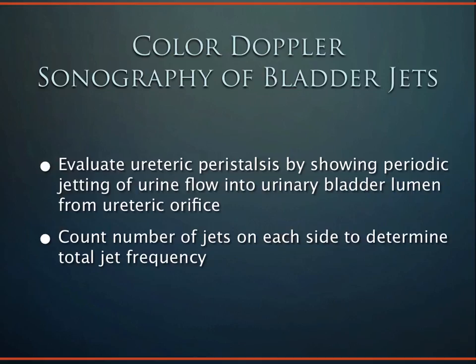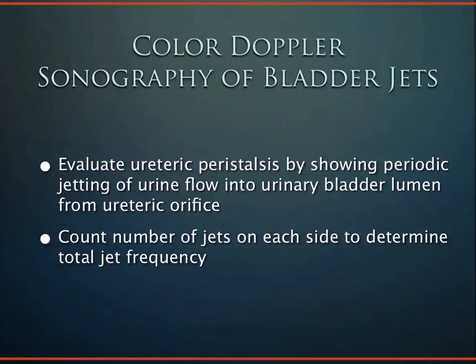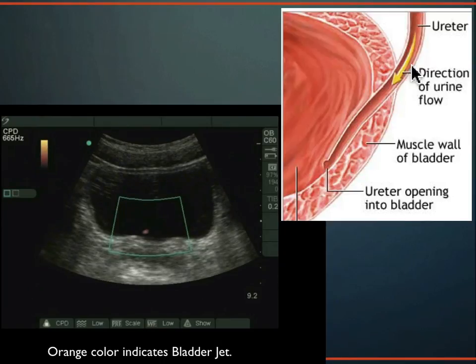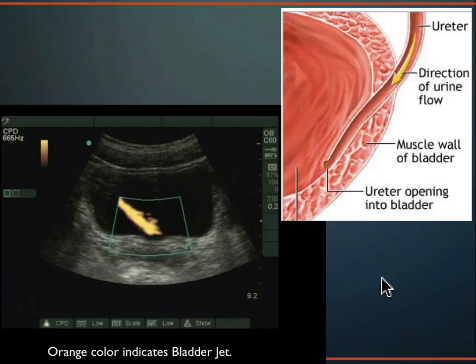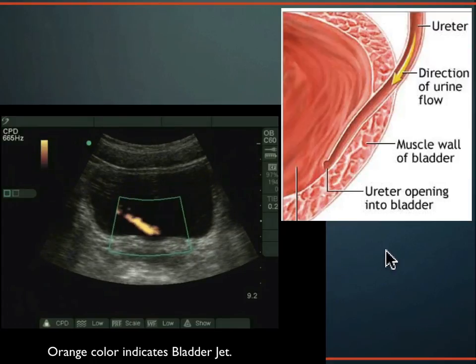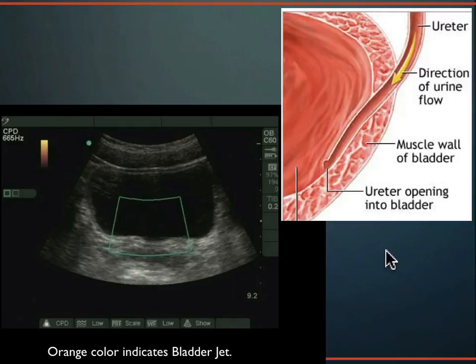Something cool about bladder ultrasound is that using color Doppler or power Doppler, you can see jets squirting through the trigone of the bladder from the ureters. On power flow Doppler, you can see the left ureteral jet firing into the bladder, then the right, then the left again. Power Doppler is very sensitive to flow — more sensitive than color Doppler — though it has no directionality. You can toggle between power and color Doppler on the machine.